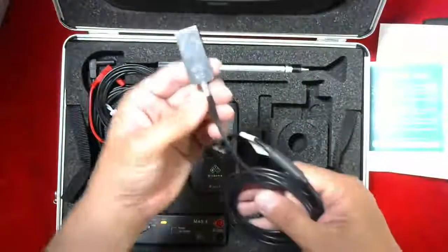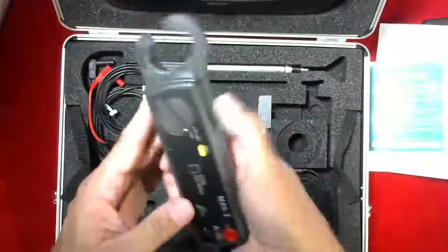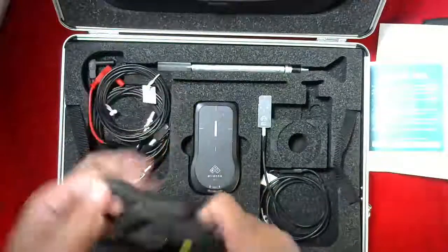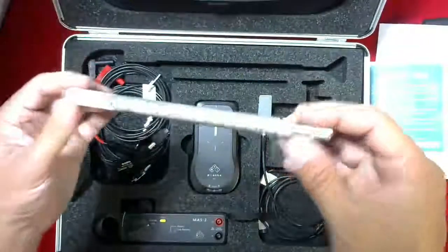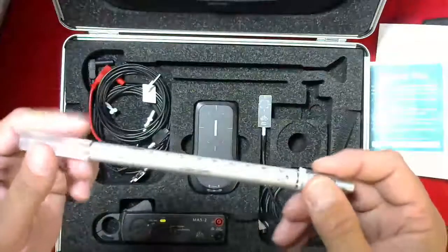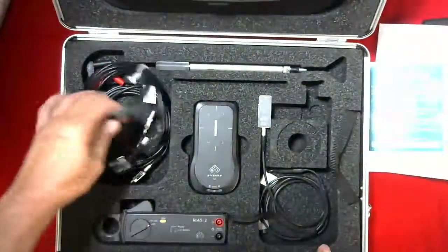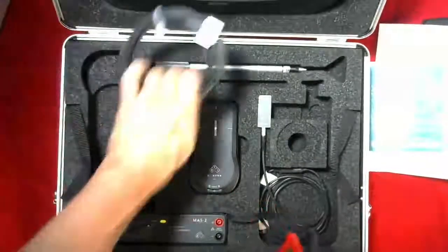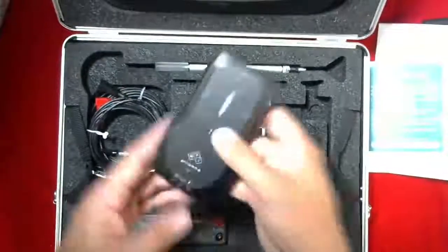This is the dose probe, for external dose measurements. This is the MA clamp for measuring MA and MAS on your high voltage cable — it clamps on your cable. This is the CT dose profiler, a solid-state CT dose measurement. This goes into the CT DI acrylic chamber and allows measurements for your CT machine. Various cables for connecting — this one connects your CT chamber to the meter, but everything is controlled by the meter.